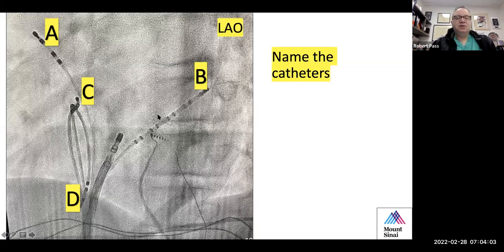And of course, you can tell from this still frame that this is one of Dr. Love's cases because he typically uses a coronary sinus catheter that's deflectable and placed from the groin, whereas, as you guys know, I usually will put one in from the neck in the IJ. And here's the ablation catheter, Tulsi.